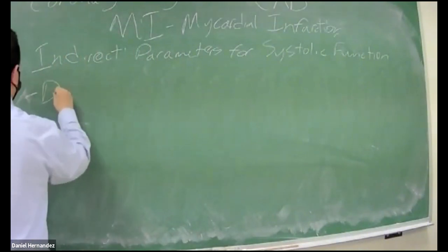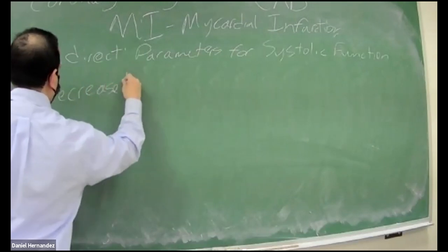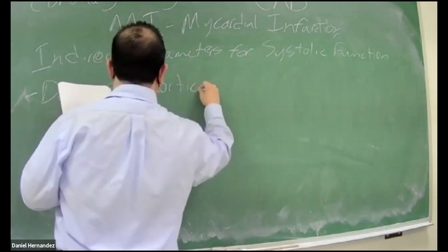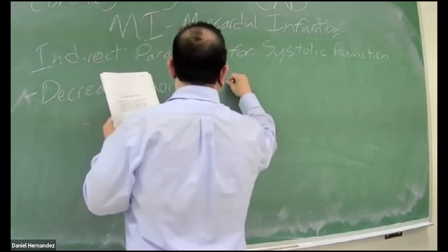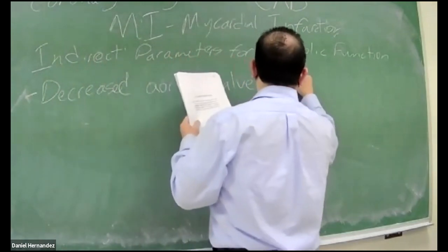And then we have the decreased aortic valve opening on M mode.